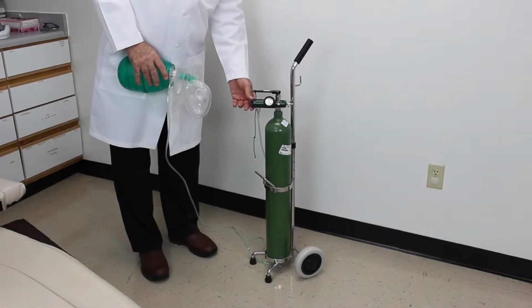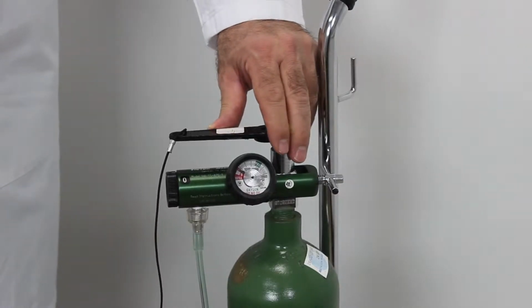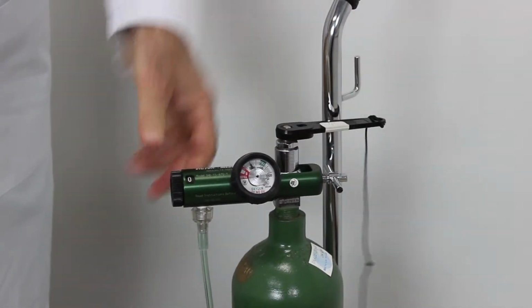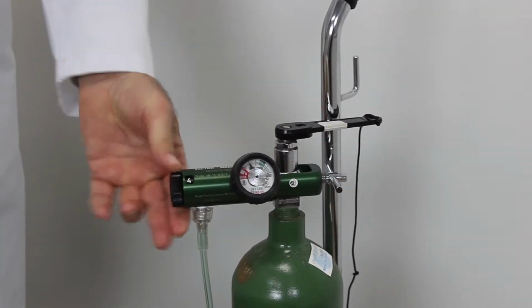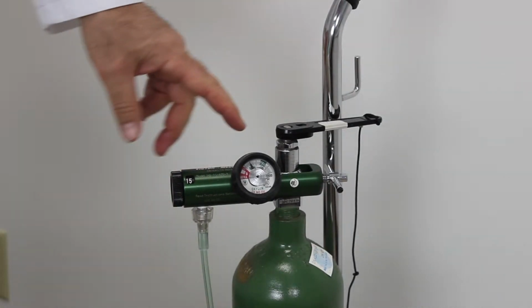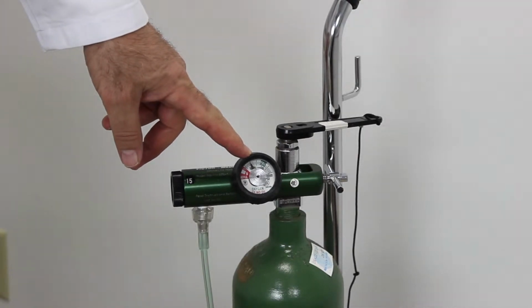The oxygen is usually supplied in an E-cylinder. You need to turn it on first to see if there's enough oxygen in the tank. Once you get into the red section on the tank, that's less than 500 psi, you have less than 10 minutes of oxygen at 15 liters per minute. When it's in the red or near the red, I would recommend changing the tank.